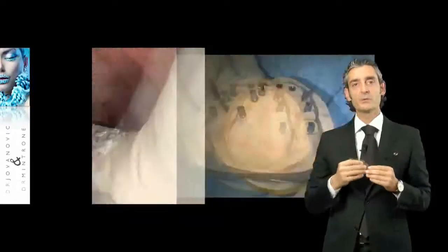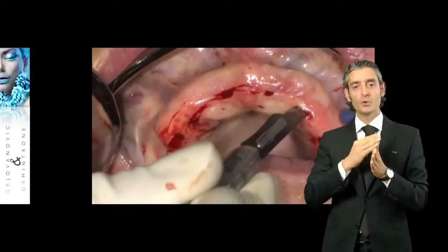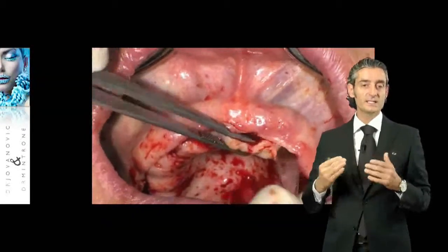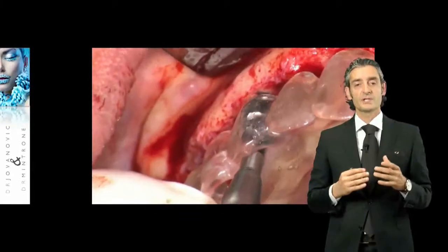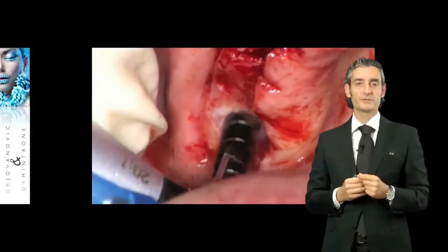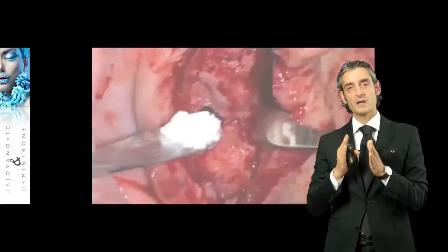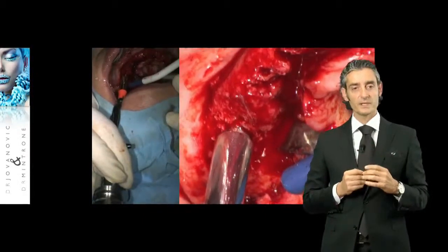With this, we are able to design our incision perfectly, and to open the flap in the best way, as you can see here. Then for sure you have to go full thickness in all areas to analyze the situation really well. Look here, there is the position of the central incisor, and then we start with our surgical guide to locate the implant exactly, considering also the position and the dimension of the future restoration. As you saw before, in this case we used the summers technique to increase the bone a little in the sinus area, as you can see here.